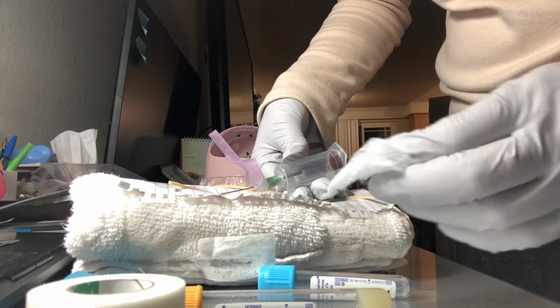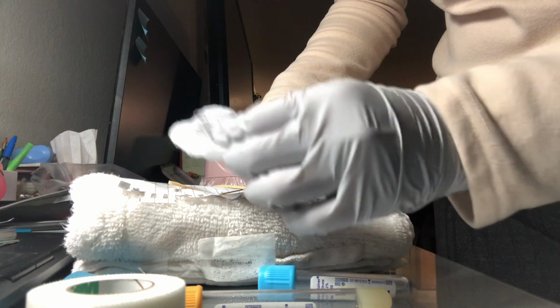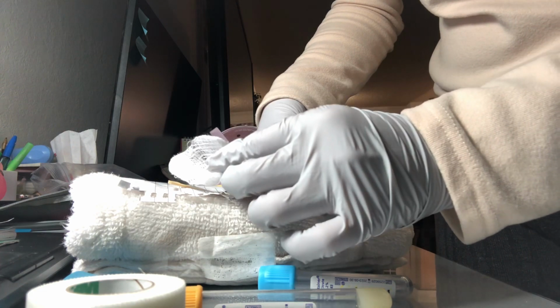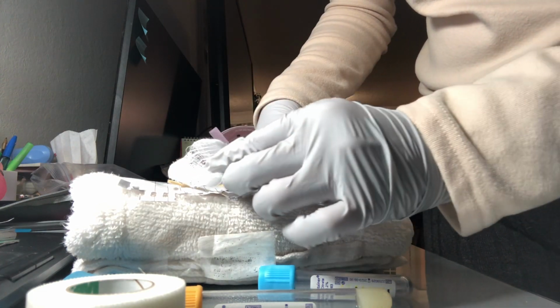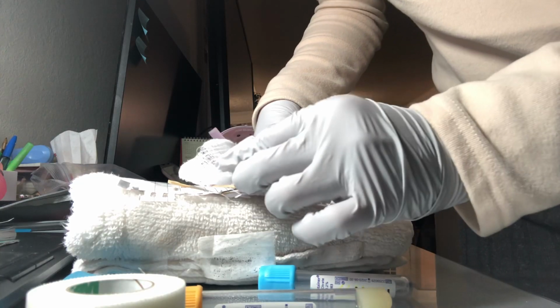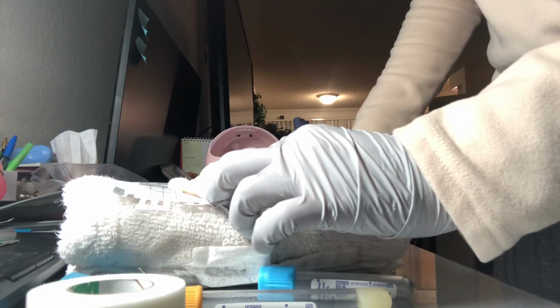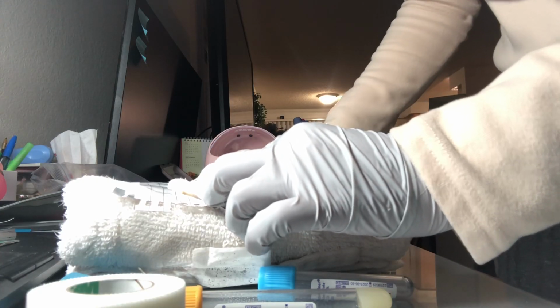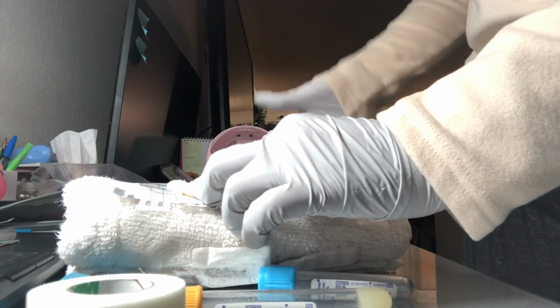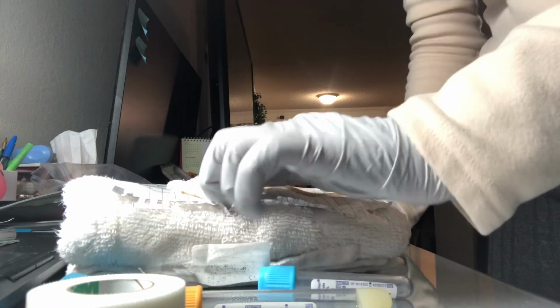Now before I remove the needle, I want to hold the gauze in a manner that won't disturb the needle, and prepare for the pressure to be applied on the patient's venipuncture site. Remove it, and safety device activated. And I want to discard it in a sharps container.